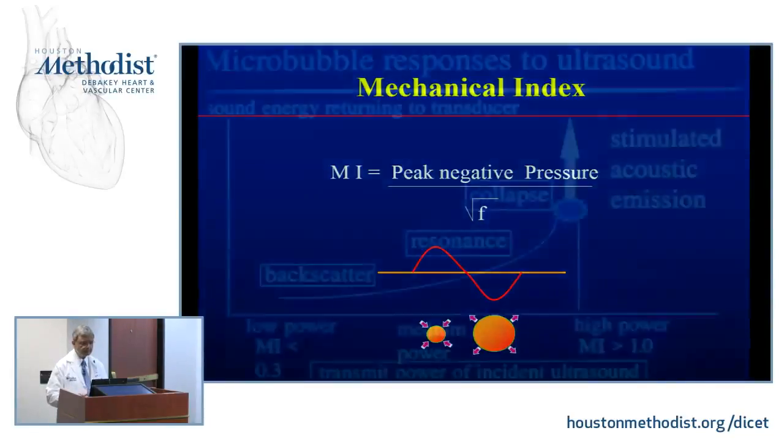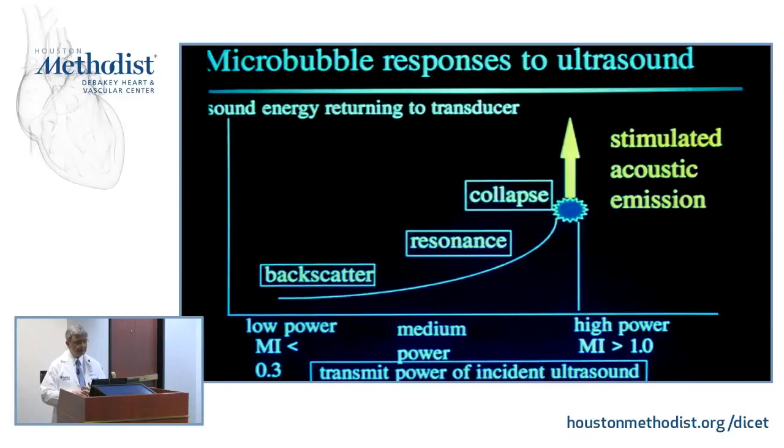today's applications. So we discovered over the years, and this illustration is, I would say, about 20 years old, that this mechanical index on the x-axis, and then lower mechanical index to medium to low power, about 0.2, even 0.15 mechanical index. So what does it mean? Well, if I'm on the high end, which is usually my routine imaging of the heart, right? If I'm going to inject contrast during this time, I'm going to destroy most of it very fast.